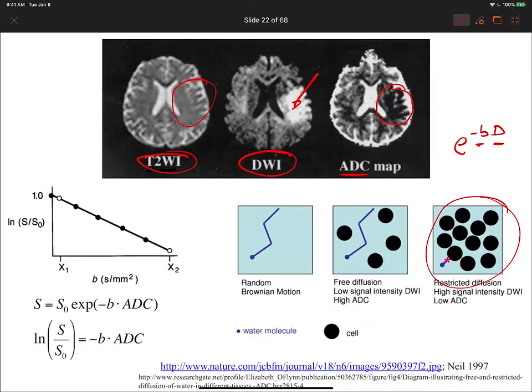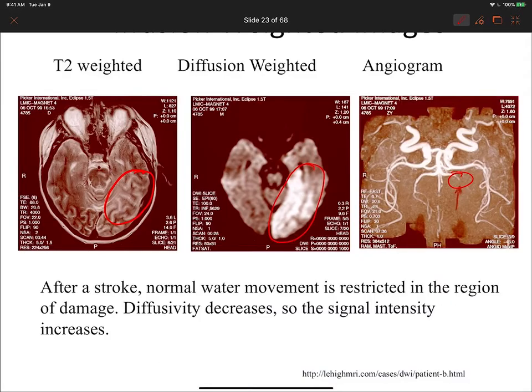Is that right in the acute phase of the stroke? Once it becomes stabilized and you have that damaged tissue with CSF increase, then would you expect later on to see more of an increase of diffusion since you have more CSF filling up? Yeah, it really depends on how the necrosis works, right? If it fills up with CSF, then you're going to have partial voluming.